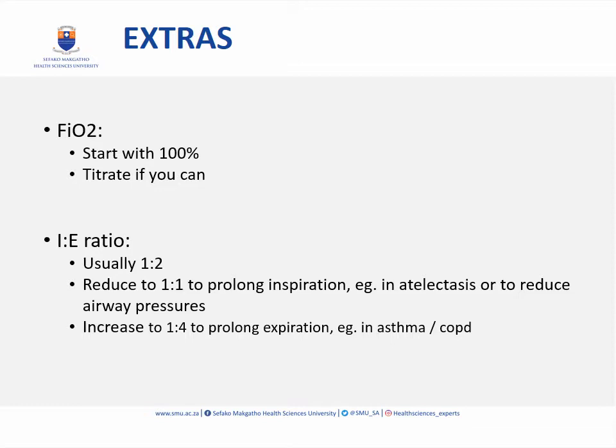And this would be, for example, in cases like COPD or asthma, where there's air trapping and you want to allow for a longer time of expiration. So that's that, and then just a last few words about setting an inspiratory pause to check for lung compliance.